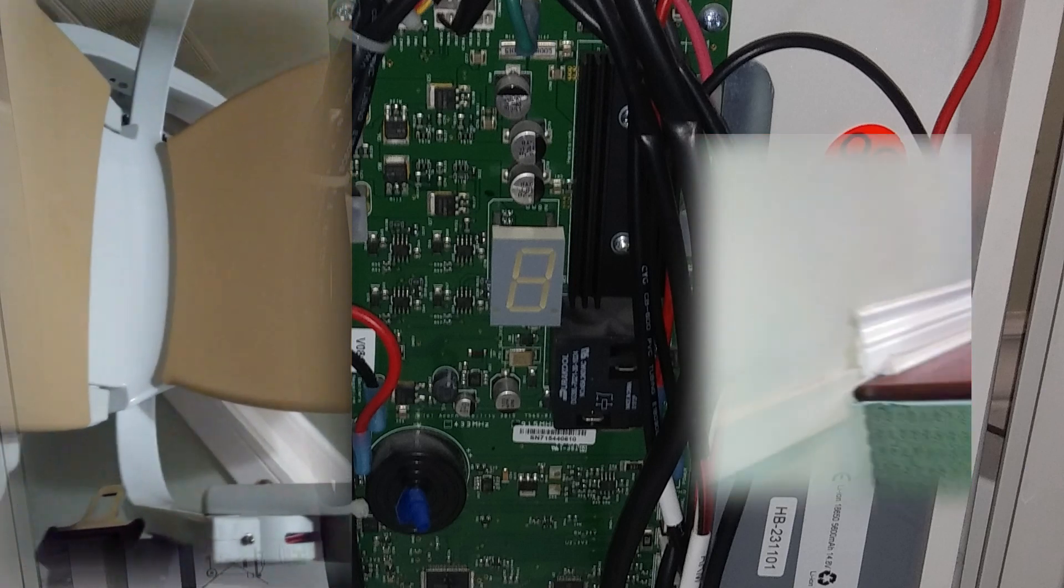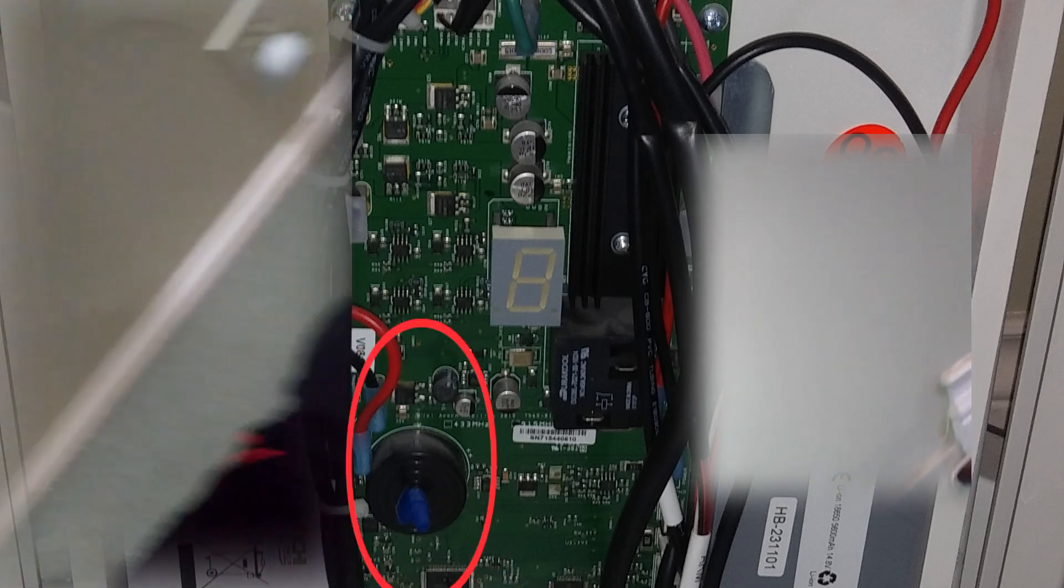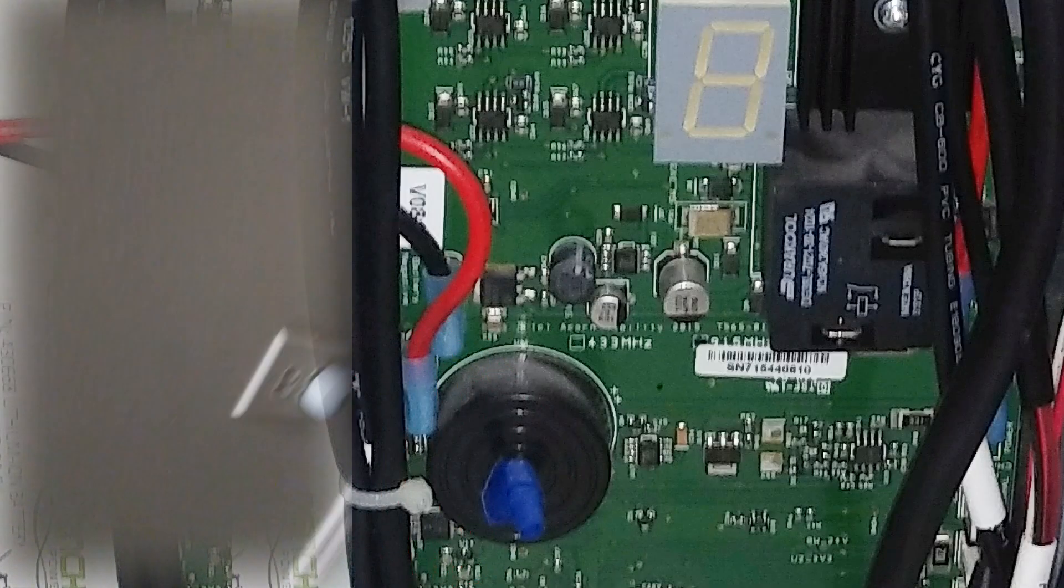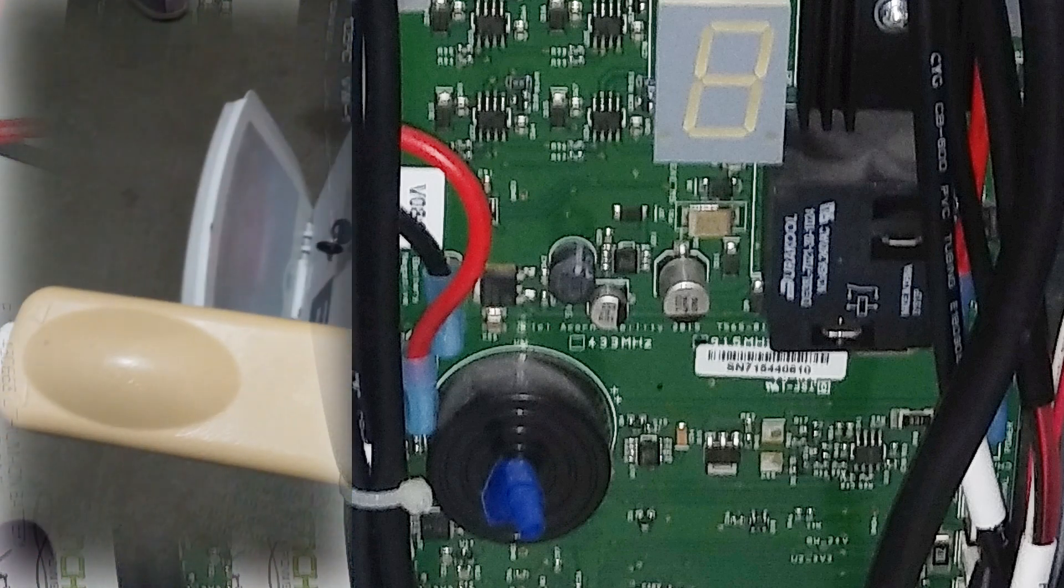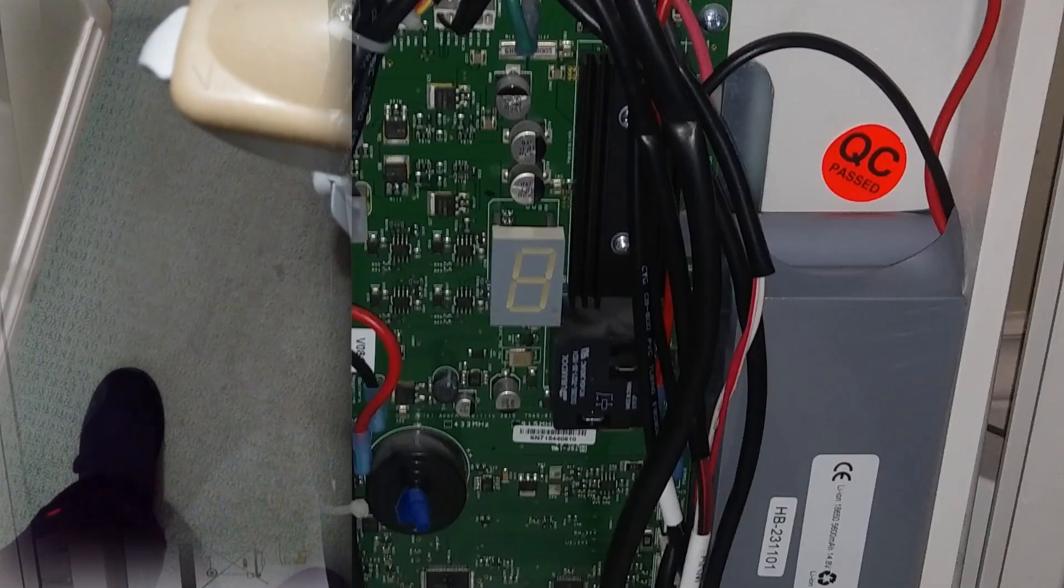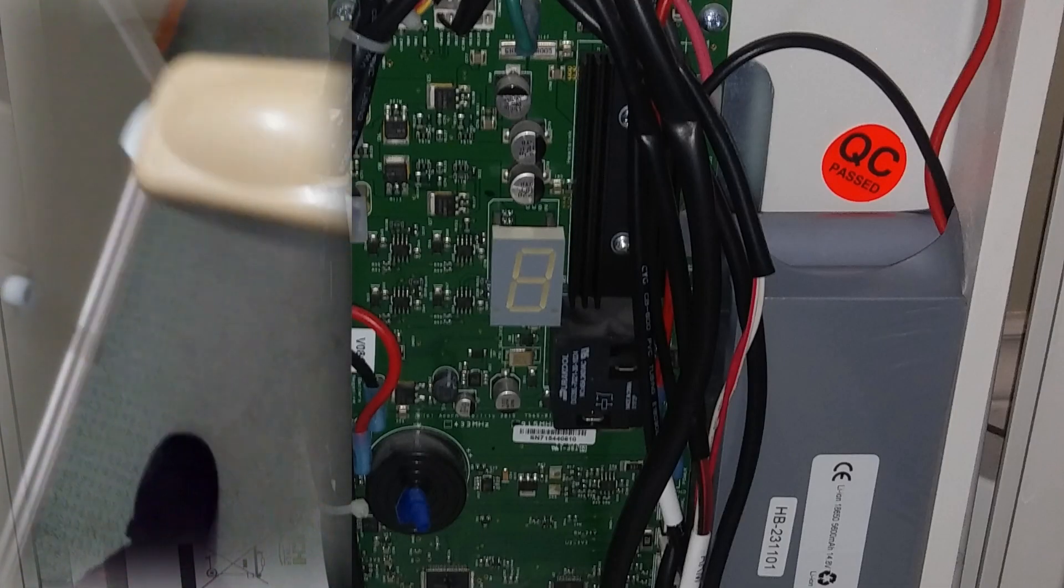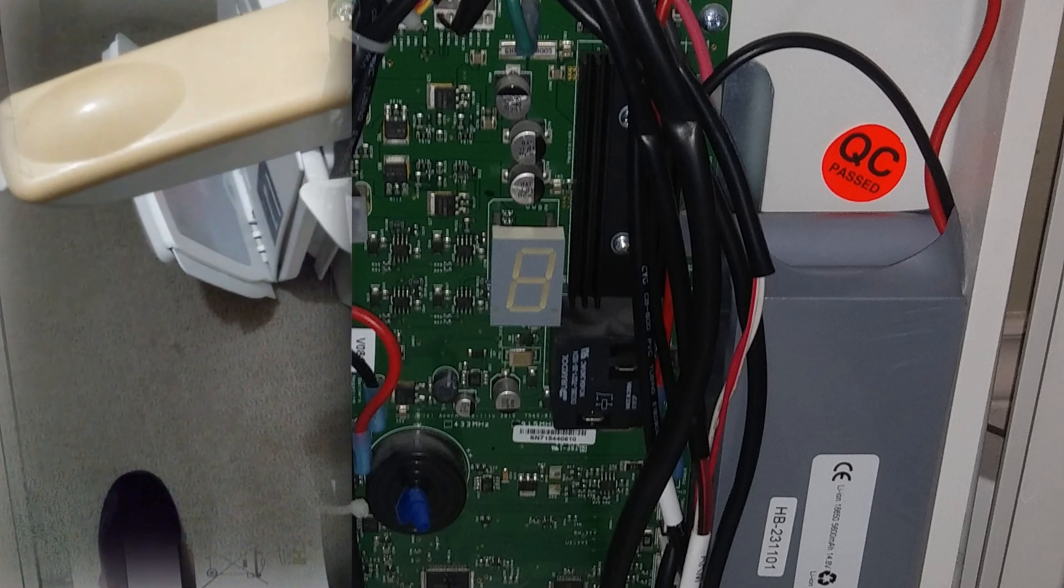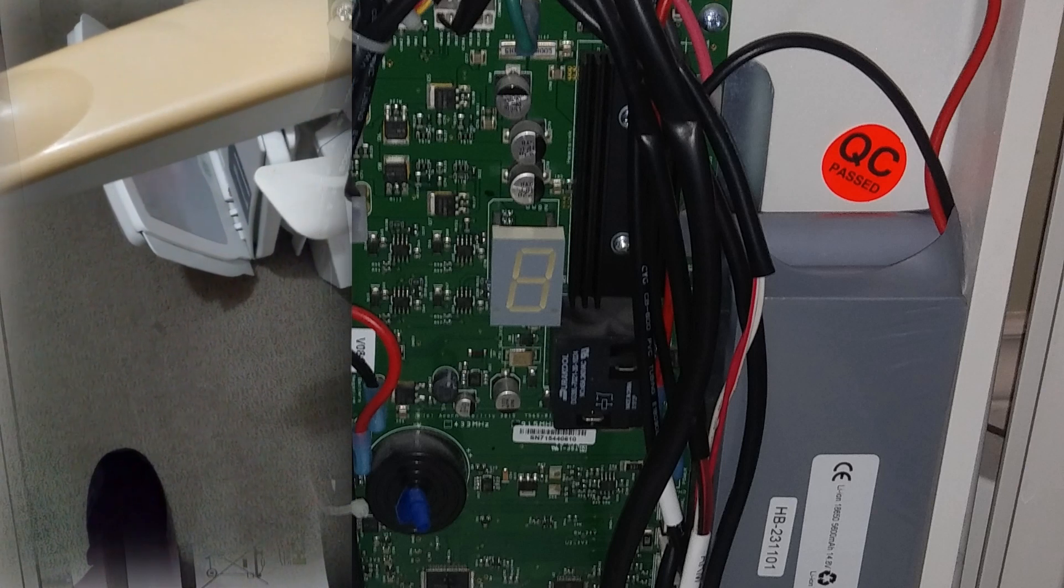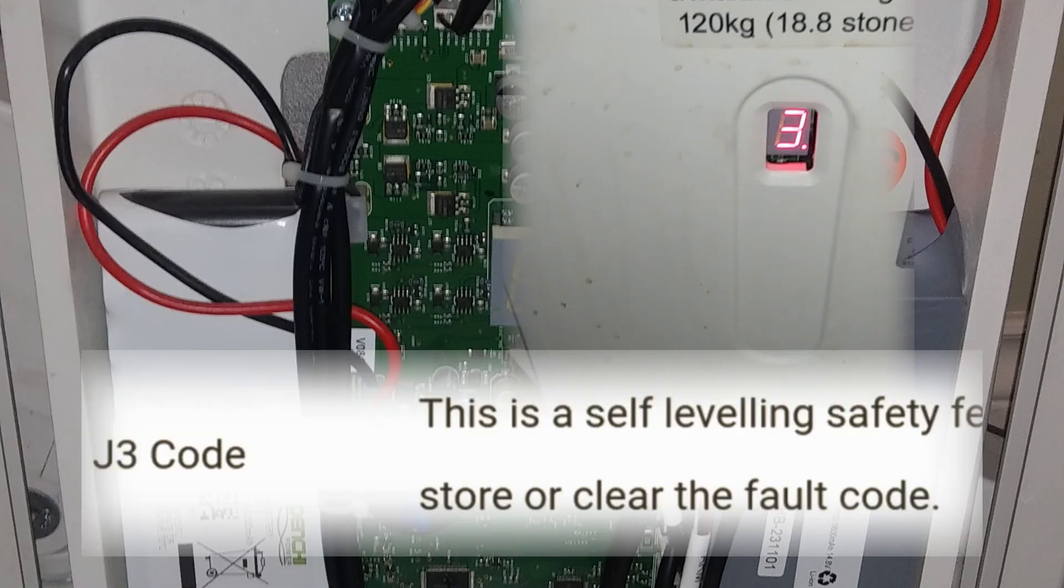This particular version has a blue thing—I'm going to call it a thing for lack of anything else—above the speaker. This model is not shown on any Acorn site that I've seen, or any Acorn schematic, installation manual, or service manual. It's a version that came out before the 2018 models.